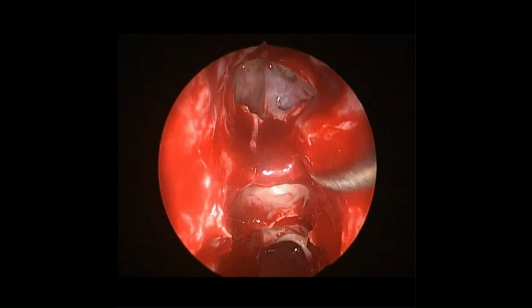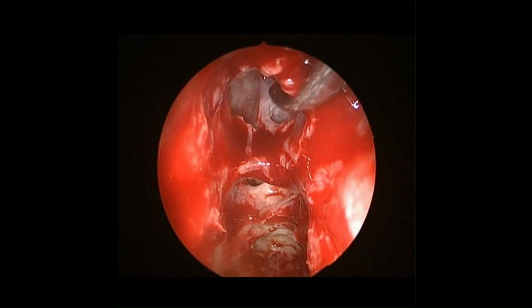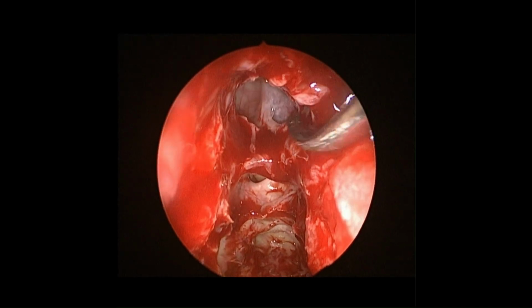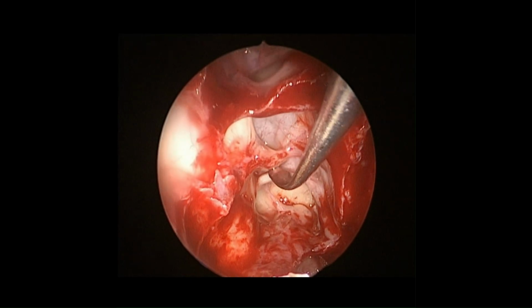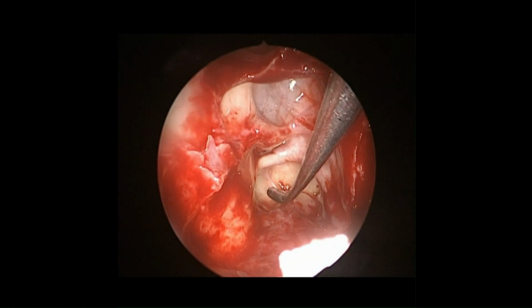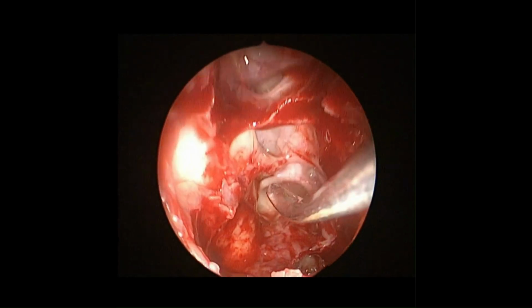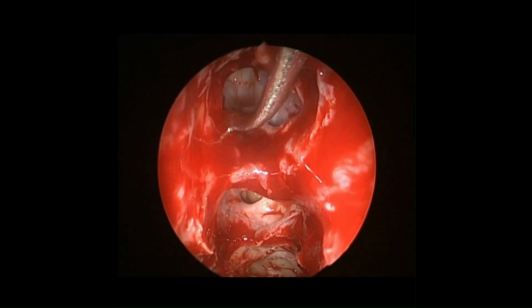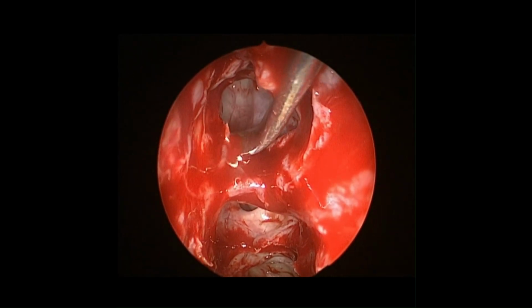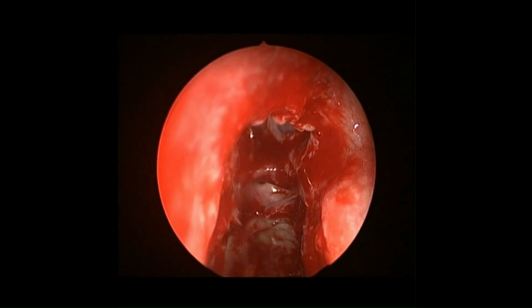On the right side also, the entire skull base is visualized and we can clearly identify all vital structures from anterior to posterior with 70-degree scopes. After complete bilateral pan sinusotomy, we are clearly able to identify the anterior ethmoid artery, posterior ethmoid artery and optic nerves on both sides clearly. Thank you.